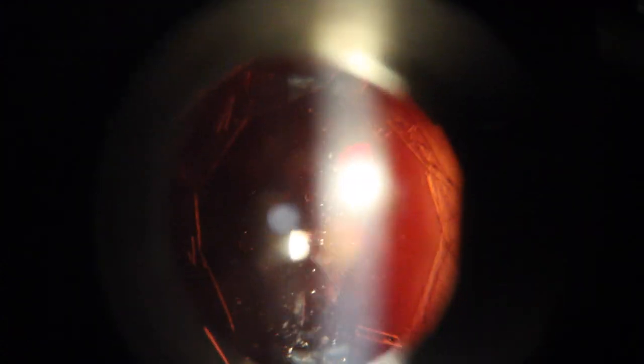Therefore, we can then attack those small remnants to help decrease the potential symptomatic complaints that people have after YAG capsulotomy of new floaters that occur from those remnants. And this is a case of using coaxial illumination to help visualize those remnants.